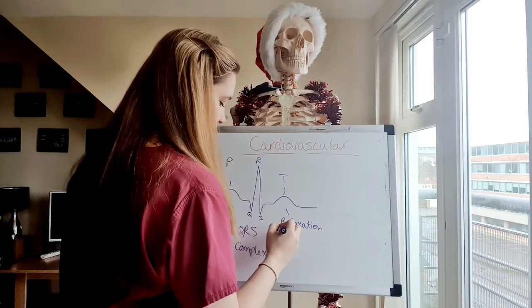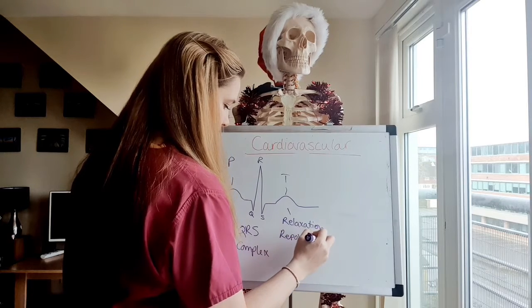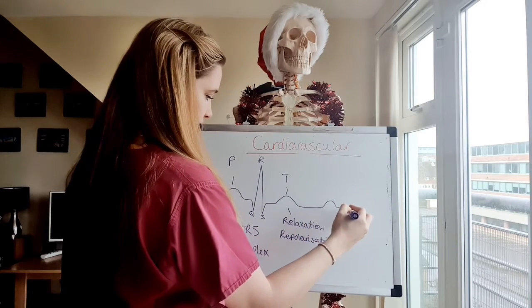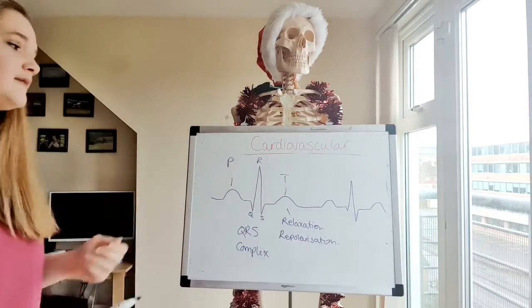Another word we call it is repolarization. So it gets ready to go back into another P wave and then a QRS. All right, that's essentially what happens.